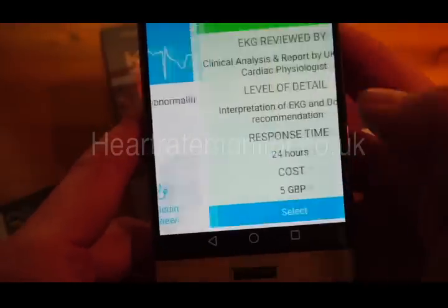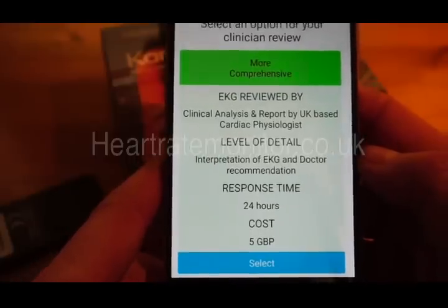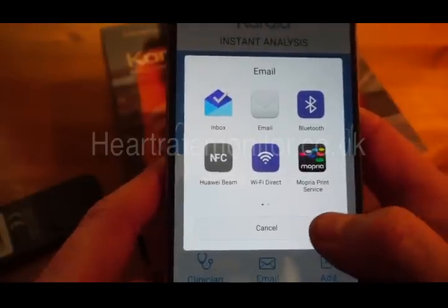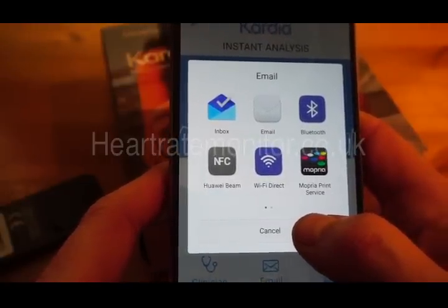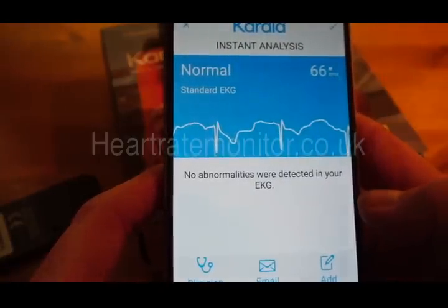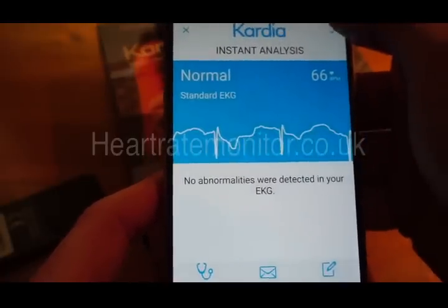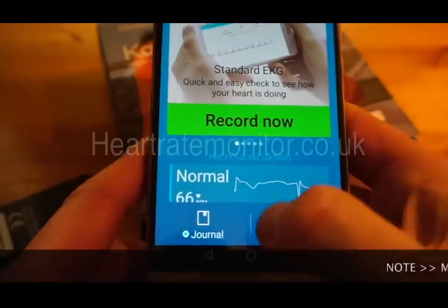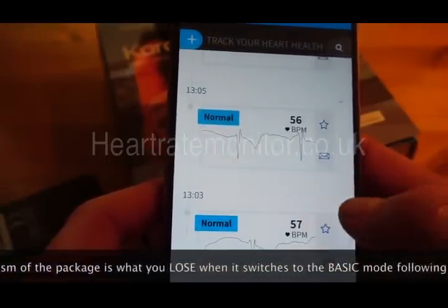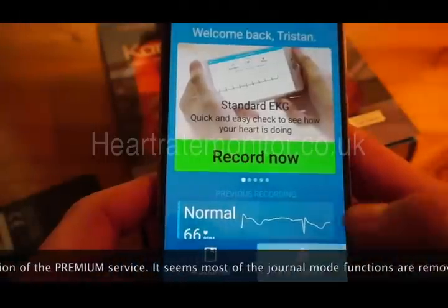If I was concerned, I can send this to the team at Cardia for a review — currently that's at £5. Alternatively, I can send the PDF of the trace by email to my GP. I can also add personal notes — for example, if I don't feel well, I'm on medication, or I've changed my medication. To save it, just tap there. There's also a journal feature at the bottom.